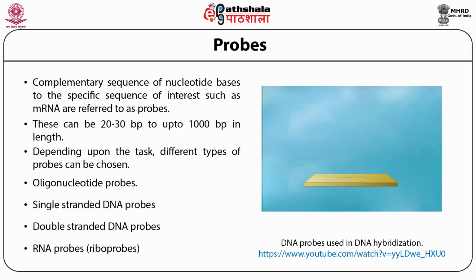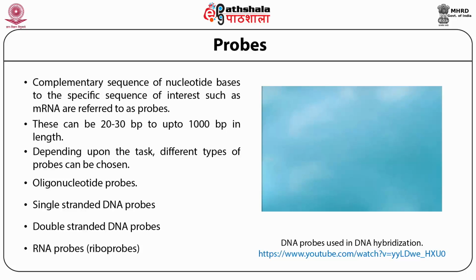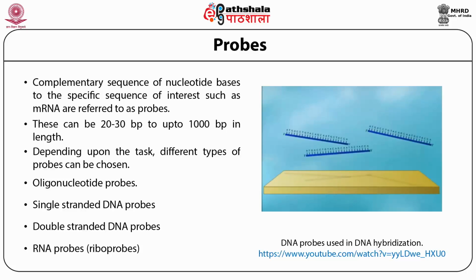RNA-RNA hybrids are very thermostable and are resistant to digestion by RNases. So, post-hybridization washes with RNases can be done, making it possible to remove any background stain and remove any non-hybridized RNA.